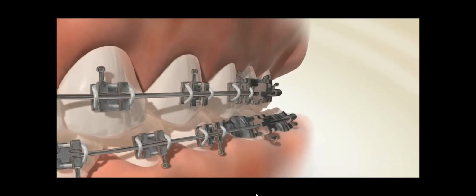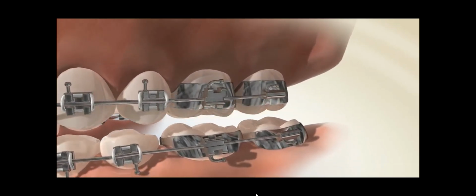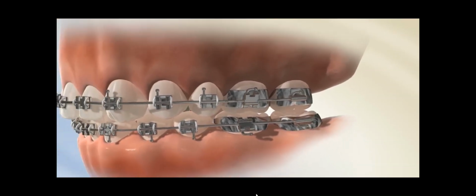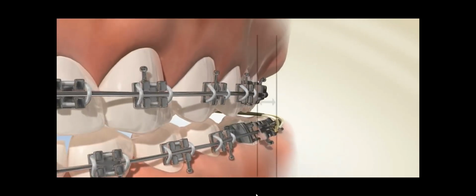The clip here shows correction of crossbite using crossbite elastics. These elastics are worn from the palatal surface of the maxillary molars with help of a lingual button to the buccal surface of mandibular molar.